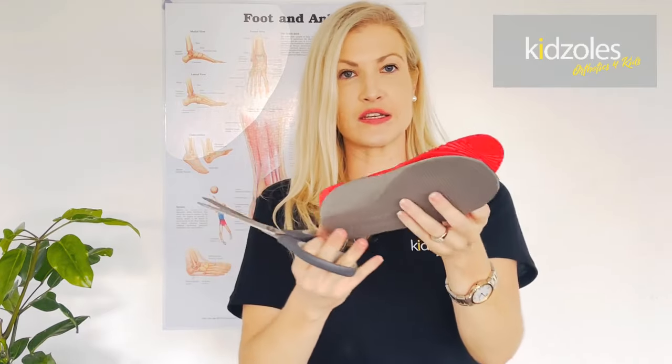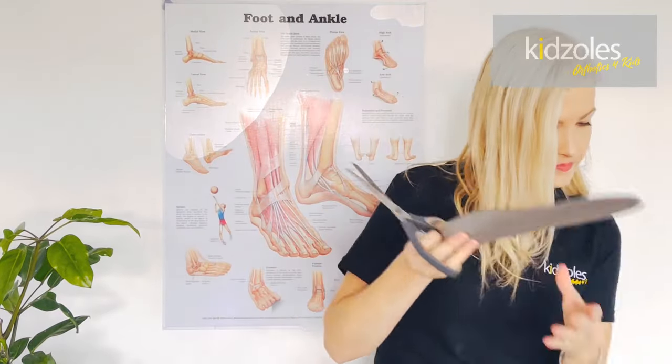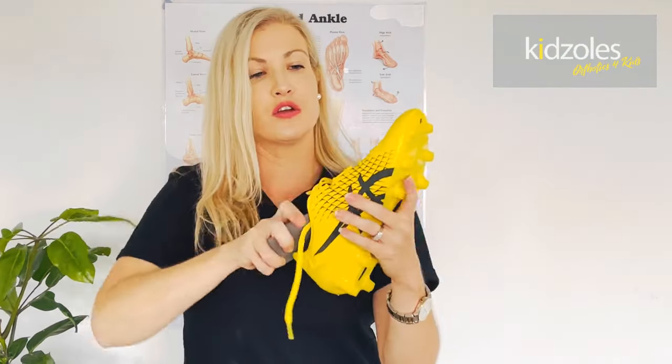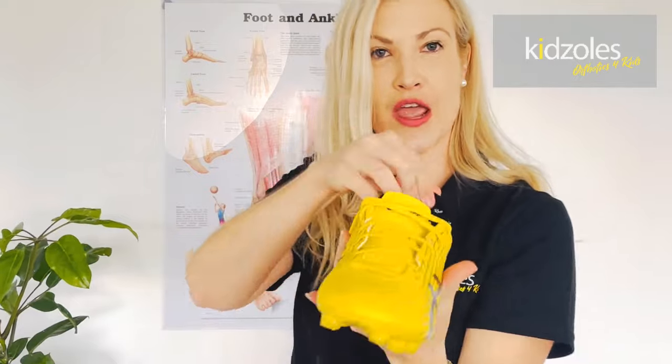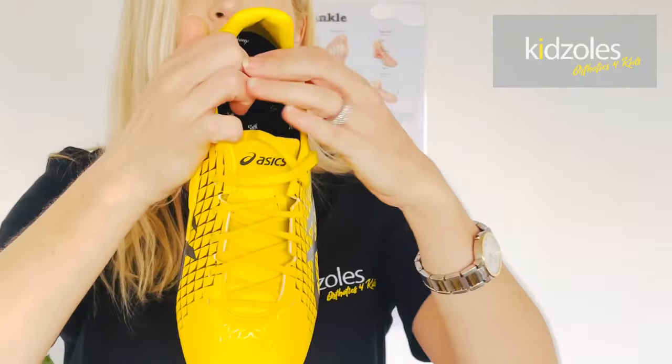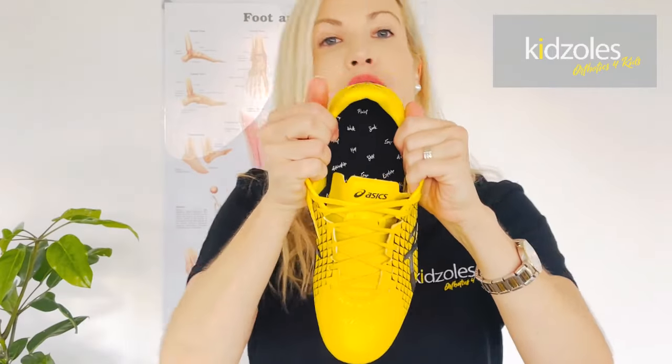You've cut it to shape — super simple. Open up the girth of the shoe and don't feel like you're going to hurt it; jam it down there and then push in the center of the heel to get it to fit. That is now ready to go.